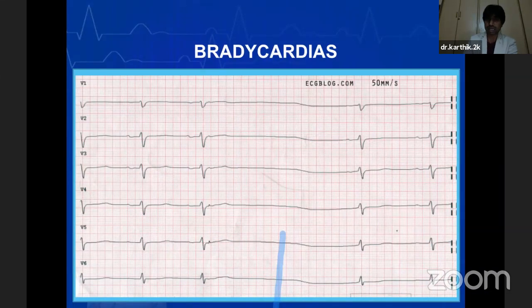So this is another illustration. If you see leads V1, V2, and V3, although it's not very clear in V4, V5, V6, you can see that there is a P wave followed by a QRS complex in beats 1 and 2. However, the PR interval is quite prolonged until the beat completely disappears. So this is a problem which is happening at the AV junction.